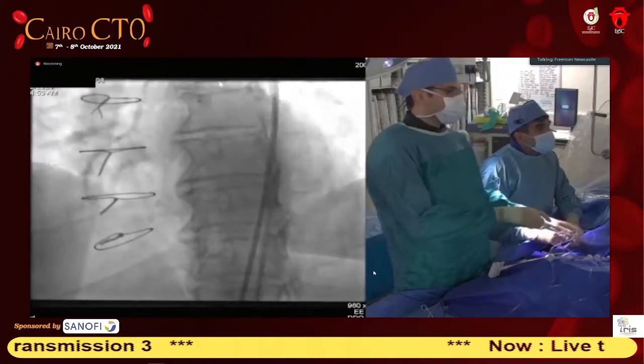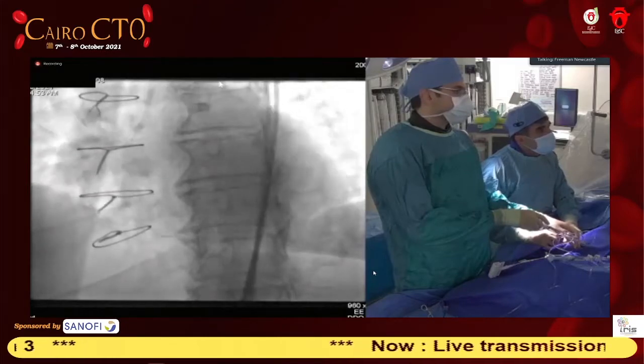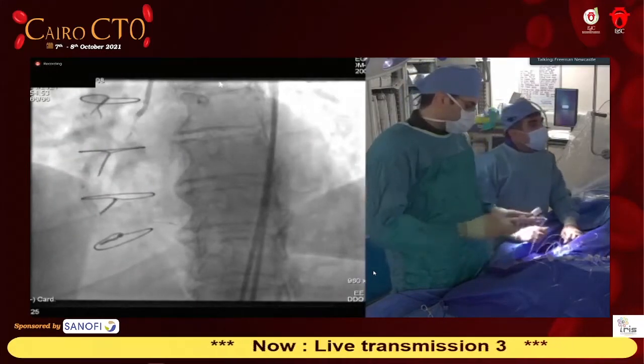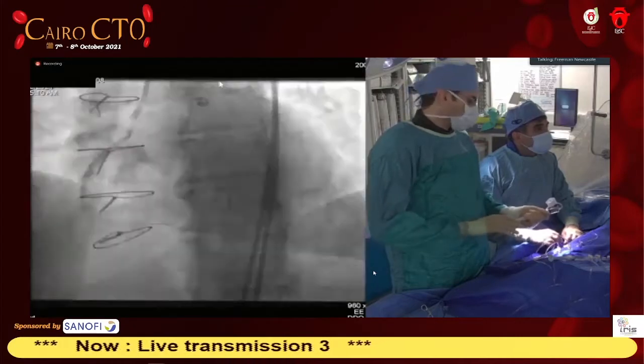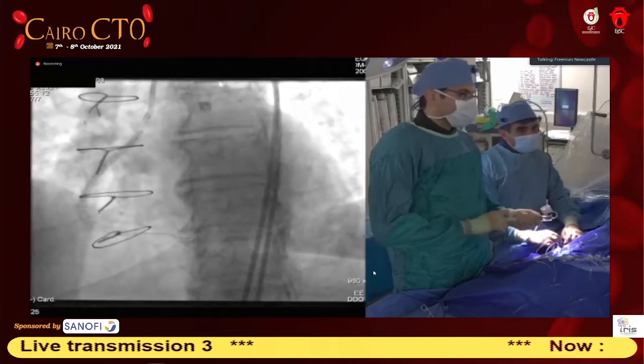As you saw, once you've swapped to an antegrade approach, it's just with the same normal angioplasty, really. That's there. Okay, go up there. Just want to see how long. I think we probably need a 28. 8, 10, 12. Store and down.